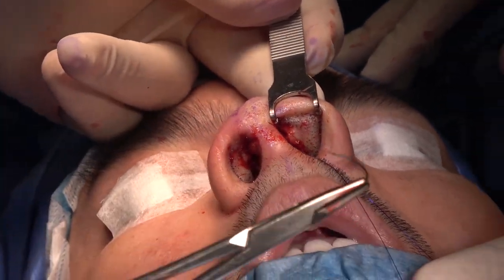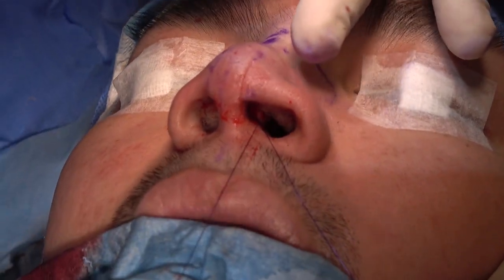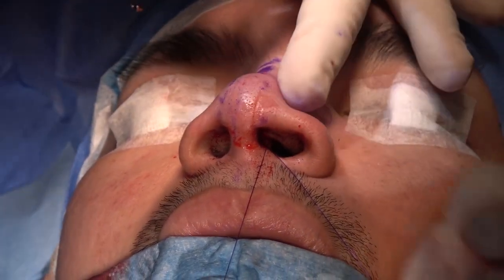Again, through the lateral crus, as you see on the other side, you see the effect of the suture there, giving more definition of the supra-alar area.